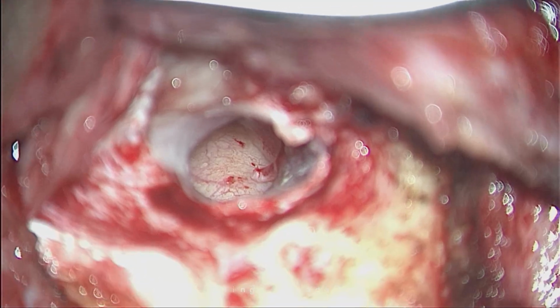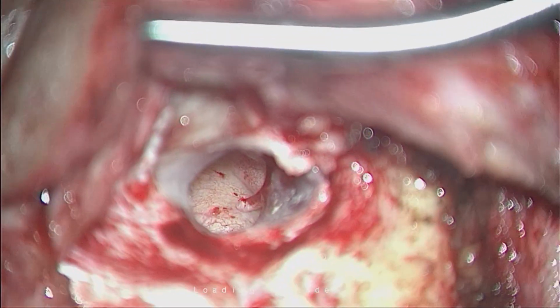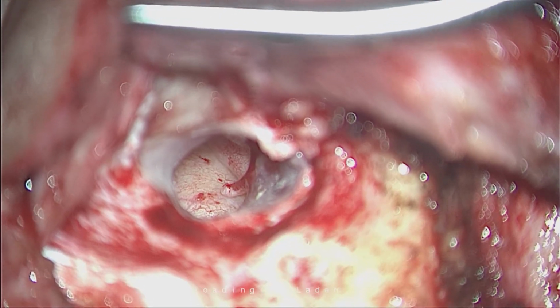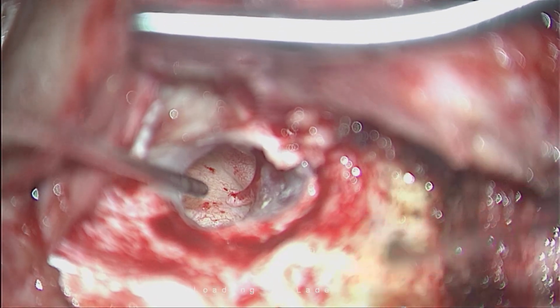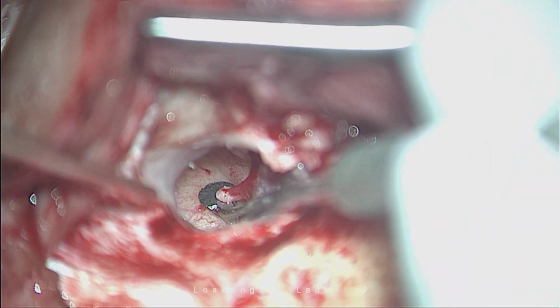Satish, does the malleus seem a little bit retracted? A little bit, not much. Yeah, there is space between the promontory and the malleus. Yeah, adequate space. See this? Yeah.